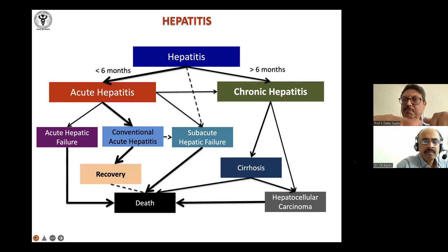But first, on the lower power, you see the entire architecture. Whether there are nodules, whether there is any inflammation, particularly in certain portal tracts, like in HCV, it will be there. Then you take your focus to that side and start from that end. See if there is any cholestasis. If it's repeating in all the centrizonal areas, then there's some problem in the distal bile ducts. You're seeing cholestasis everywhere, and so on. So that's how it's done.